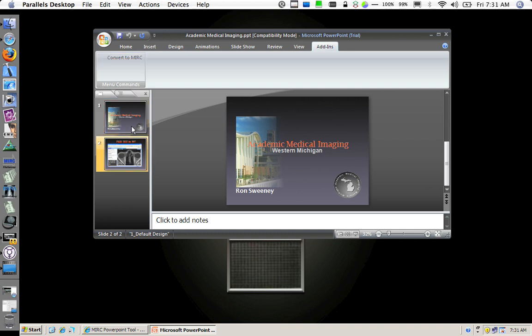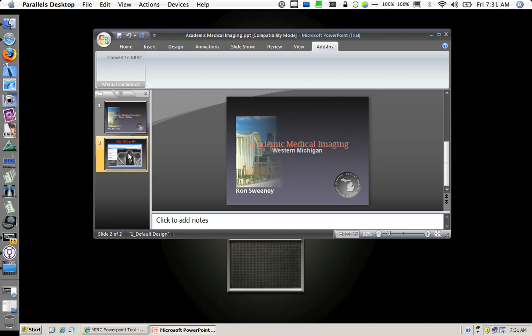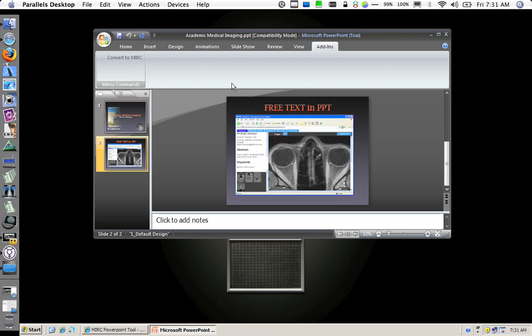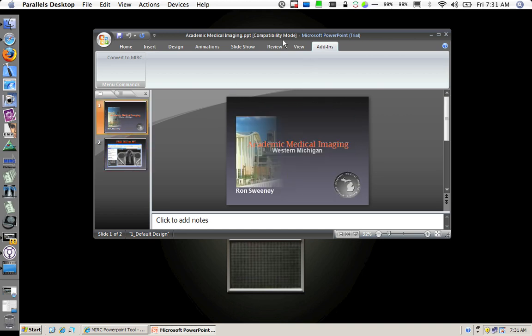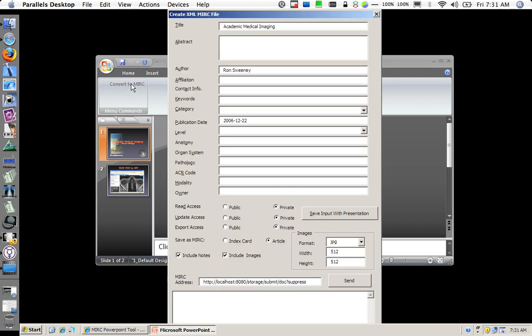Here is a small two-slide presentation that I want to send to my MIRC site. So I will click convert to MIRC and a dialog appears.